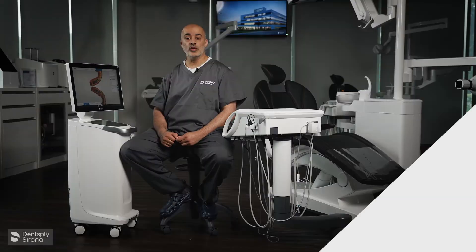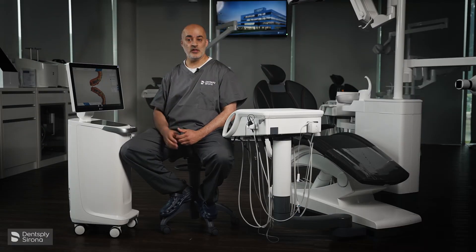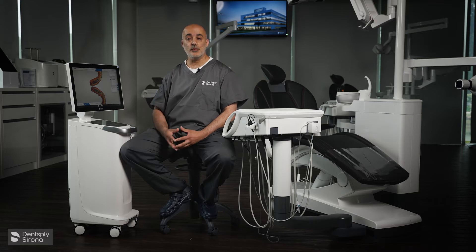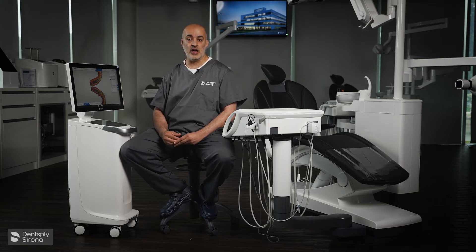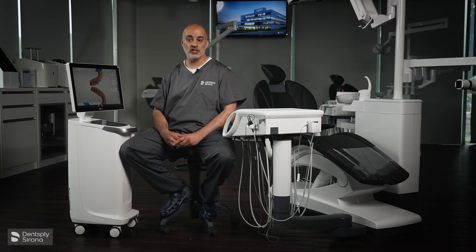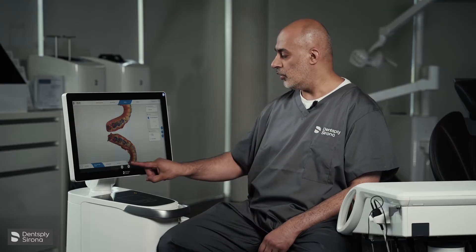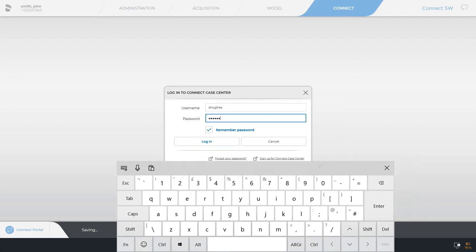We're now ready to move on and send the scan to the lab. If you're going to use the Connect portal, you need to have a Connect Case Center account. If you don't, you need to contact your Dentsply Sirona rep. We'll move on — choose the right icon and you will notice you have a login for your Connect Case Center account.